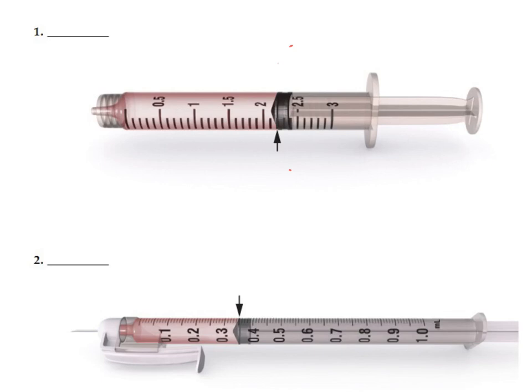Okay, so let me show you how these will be listed on URLs. As you can see on the screen here, number 1 and number 2 both have a stopper and an arrow on the screen for you. So that's how you will see it on URLs quizzes, as that's the easier way to do it on a computer. Again, like I said, it's harder to draw a line on a computer, so this is going to be easier. So on number 1, I will ask you how many milliliters the nurse, or the medical assistant, whoever, has drawn into this syringe.